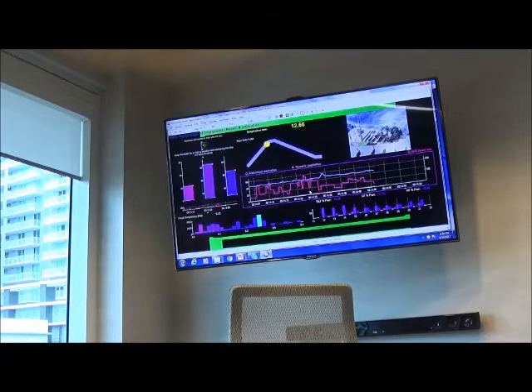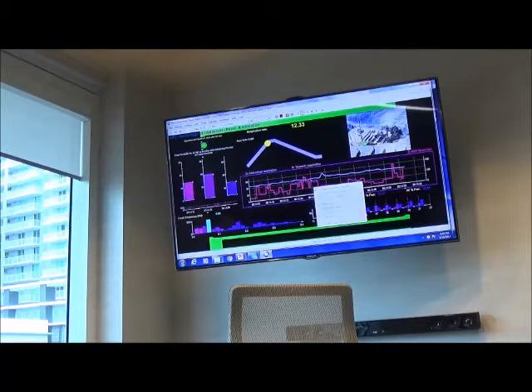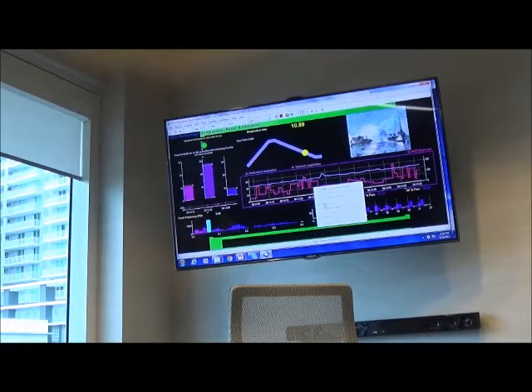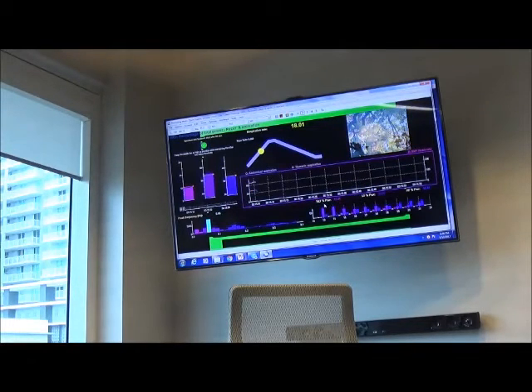If you wanted to zoom in on the blue, so we have it on auto scale right now. So we have to take it off auto scale and that's the right click. Right click is off auto scale? Yeah. And so you either check it or don't check it. If you want to zoom in then you uncheck it. So now it's on manual scale.